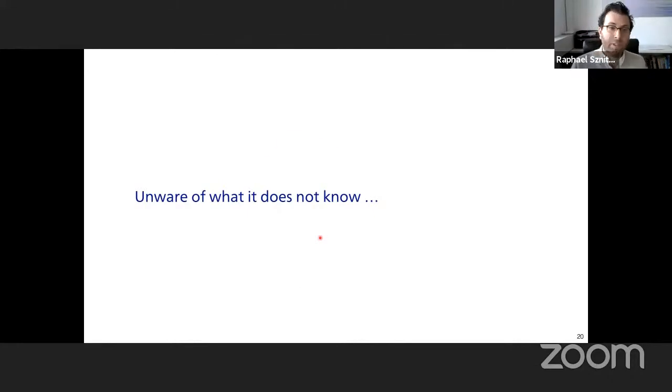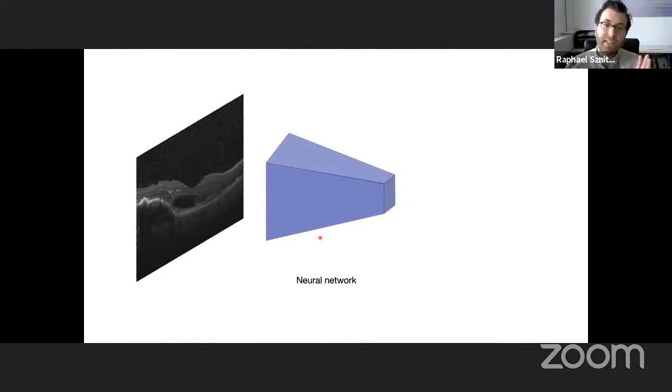And what do I mean by that? So I'm going to switch context out of surgery and into diagnostics. In this case, it's in the context of OCT imaging, so optical coherence tomography. So this is eye care mainly. This is an image of a cross-section of an eye scan. And here what you see are parts of the retina. And in fact, what I'm going to be talking about is unrelated to the anatomy. It's unrelated to the application itself. I'm just showing you a generic problem, in fact. So this will translate to MRI, to CT, and so on and so forth.